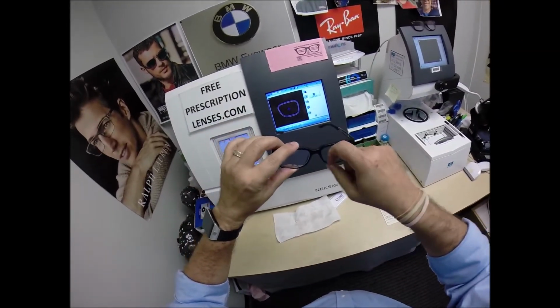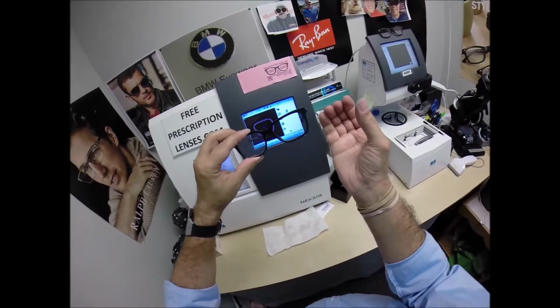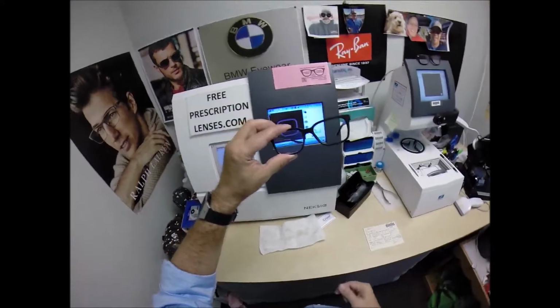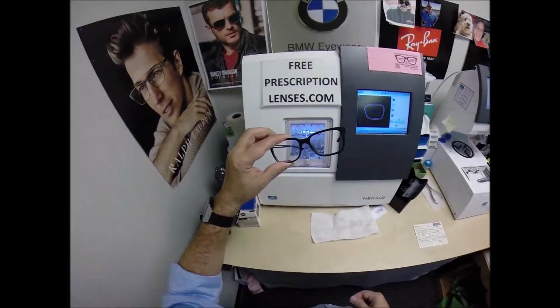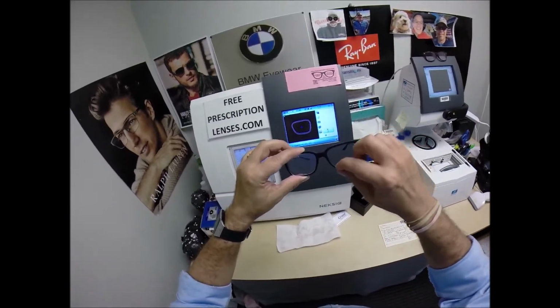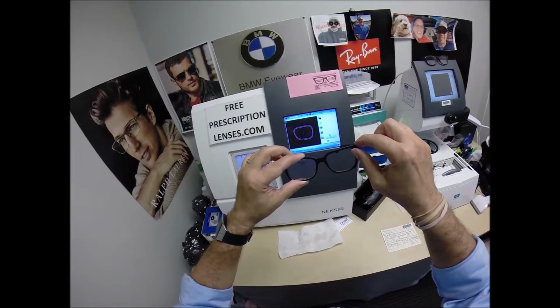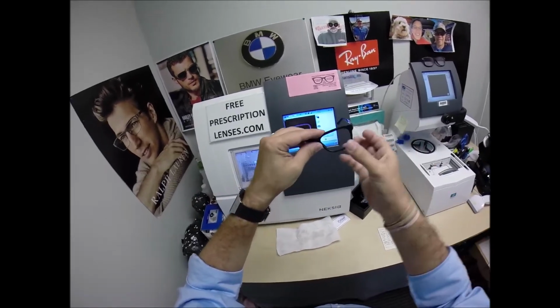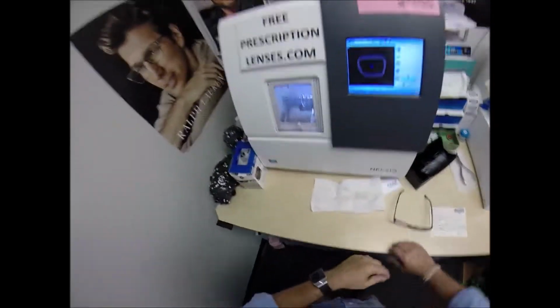If you can imagine the bottom of your frame being like a gutter, the force applied from the lens to the frame would cause the frame to roll outwards, giving you an ugly cosmetic look, as well as shortening the life of the frame. The reason why it'll do it at the bottom is that it is the skinniest, the thinnest part of the frame. You have a thicker part here and a thicker part here, so this has more tensile strength. This is going to roll outwards.